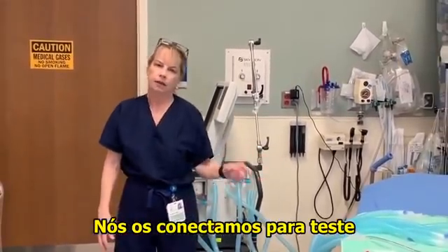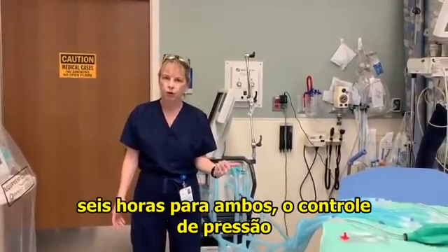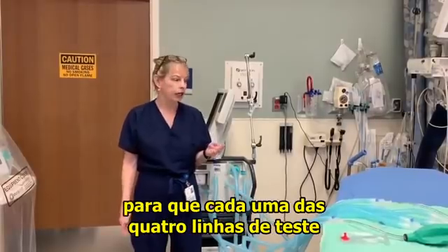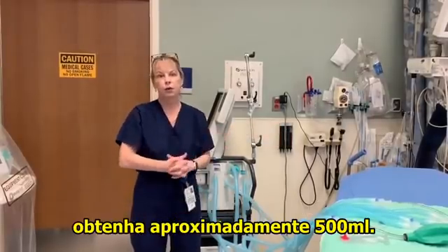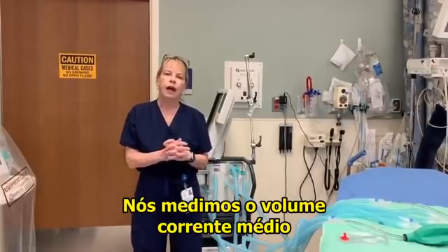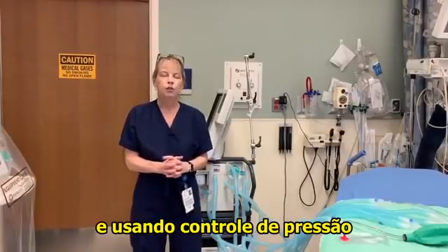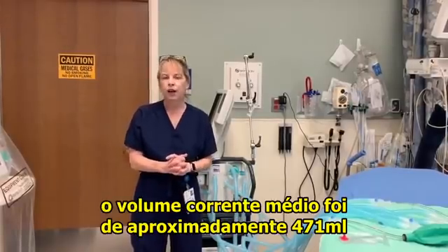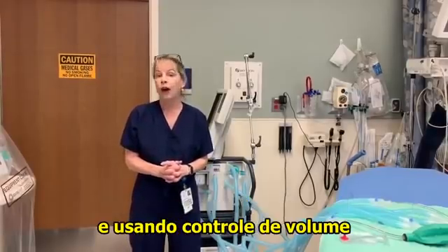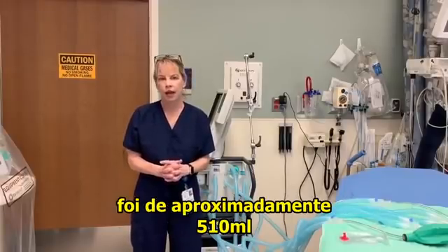We hooked them up to test lungs and watched them for six hours — both on pressure control using 25 centimeters of water and volume control using two liters tidal volume, so that each of the four test lungs would get approximately 500 mLs. Using pressure control at 25 centimeters of water, the average tidal volume was approximately 471 cc. Using volume control, the average tidal volume per test lung was approximately 510 mLs.